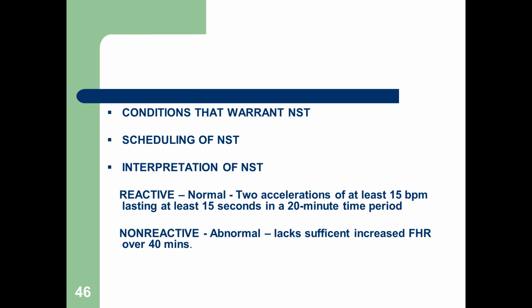It's usually scheduled in the daytime, either in the office or the hospital. It's non-fasting, but you ask the patient not to smoke, which they don't need to be smoking if they're pregnant anyway. They're put in semi-Fowler's position with a small pillow behind the right hip to displace the uterus to the left, and they're hooked up to the monitor, and they're asked to punch a button every time they feel the baby move.